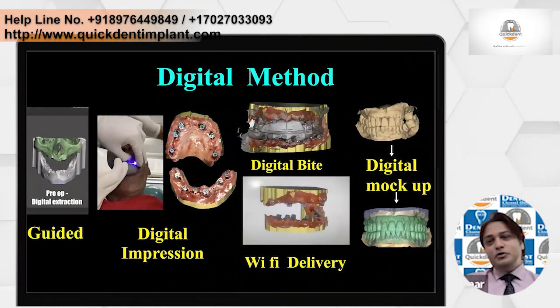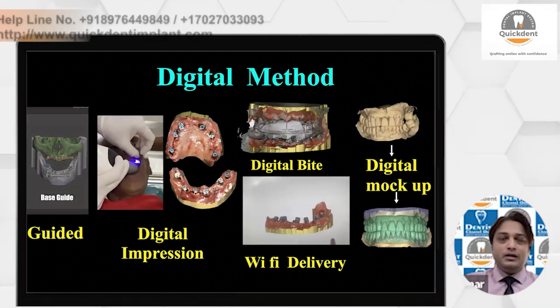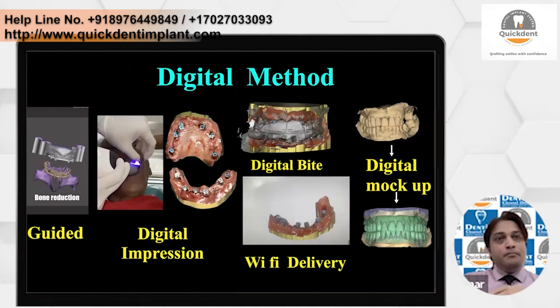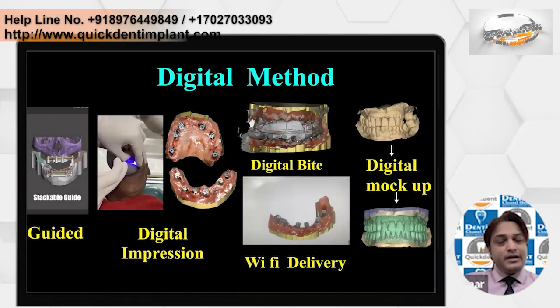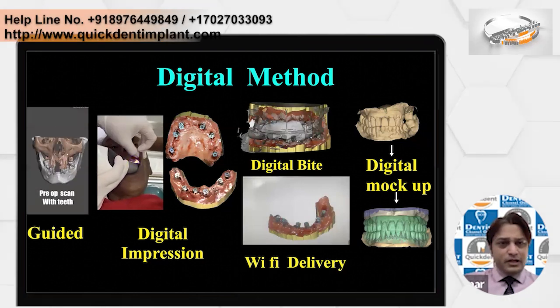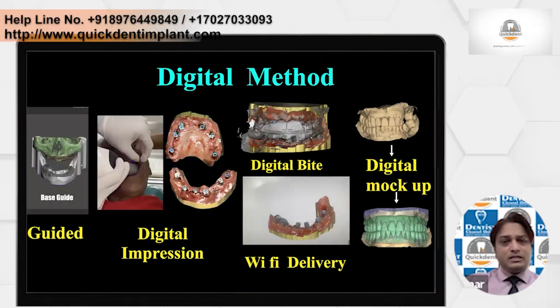So my friend, you understood about the analog method, also about the digital method. So digital method is not just about the intraoral scanning. It is about the planning before the surgery. You can do the guided, you can go fully guided, you can go pilot guided also. We are doing fully guided. So we will be coming up with more and more cases shortly with the fully guided as well. So guided is one aspect.